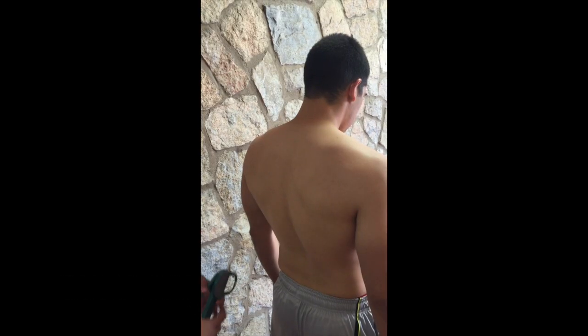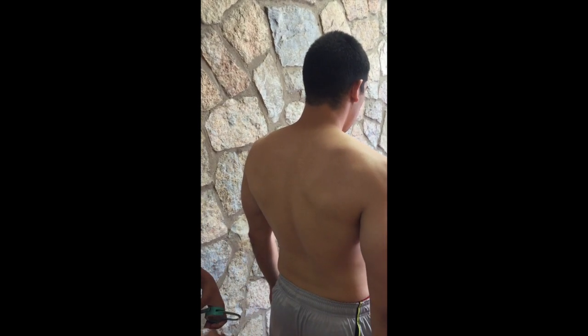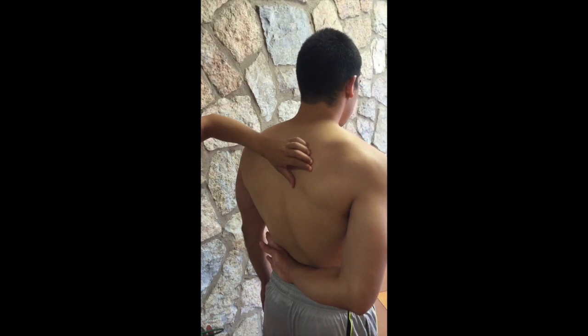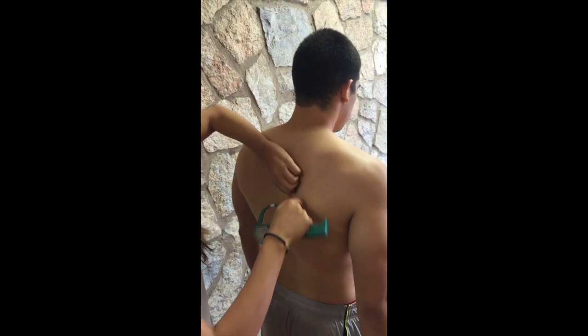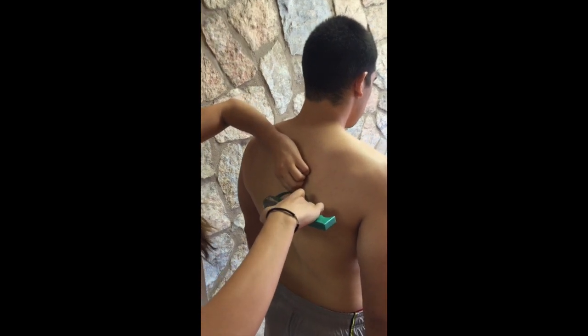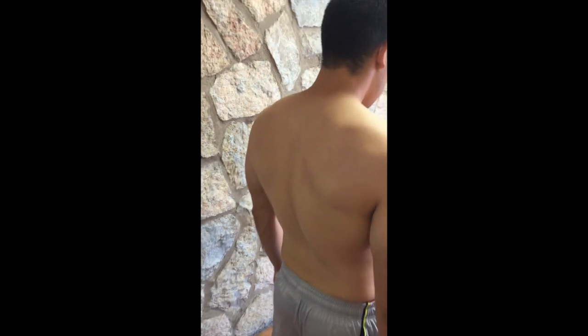The subscapular is measured using a diagonal fold 1 to 2 centimeters below the inferior angle of the scapula. Having the subject fold his or her arm behind their back allows the subscapular to be best seen and felt more easily. Then have the client release and take the measurement.